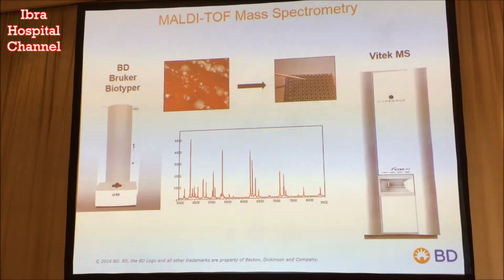And I look back now and have to laugh at that, because if you look in most laboratories, they either have a mass spectrometer system or they're considering one. It really has truly revolutionized the way we do identification of organisms. And since I'm in a predicting mood today, I would predict that if we did a survey of all the people that would attend a meeting like this in 10 years, virtually everybody would be using mass spectrometry in their laboratory to identify organisms.